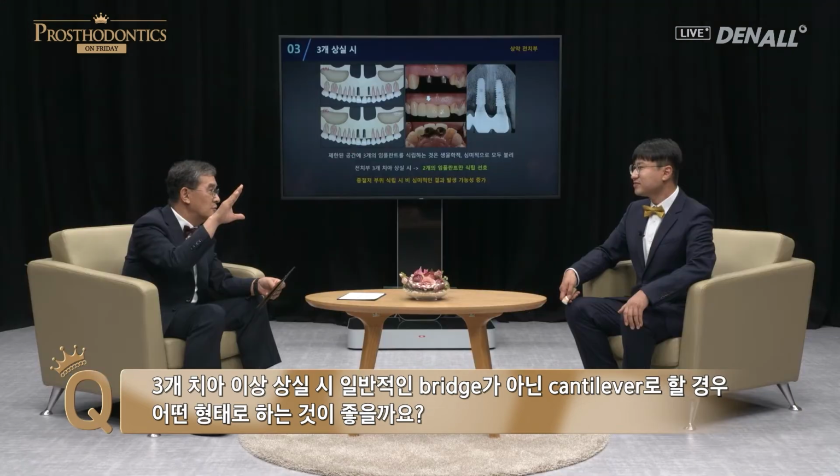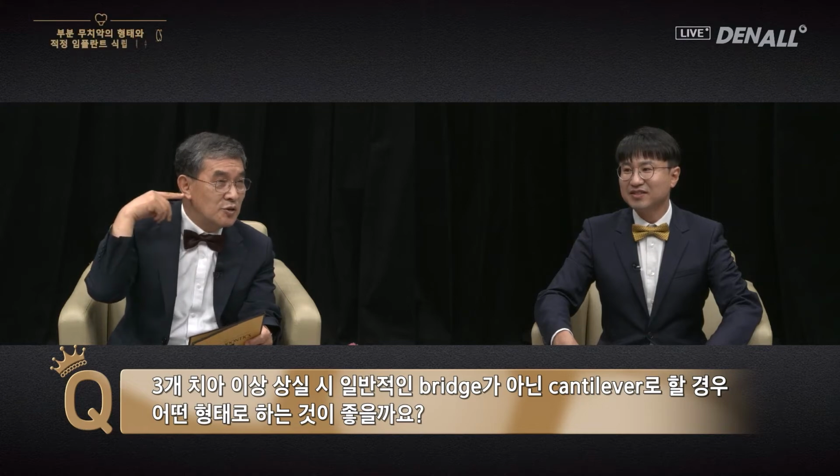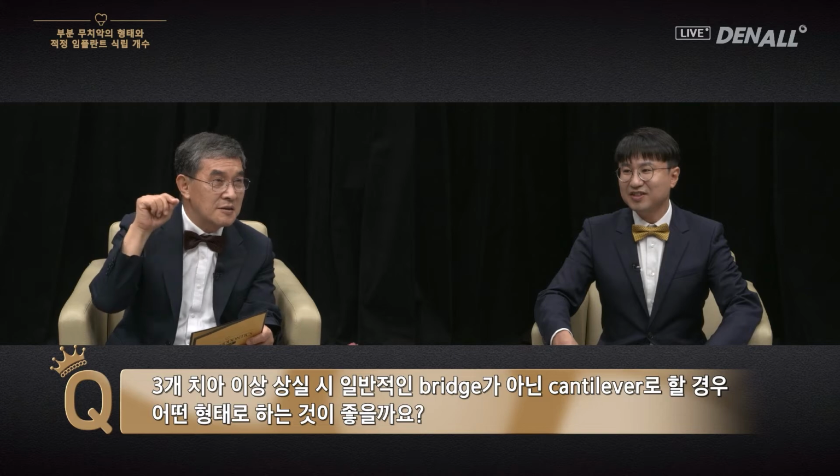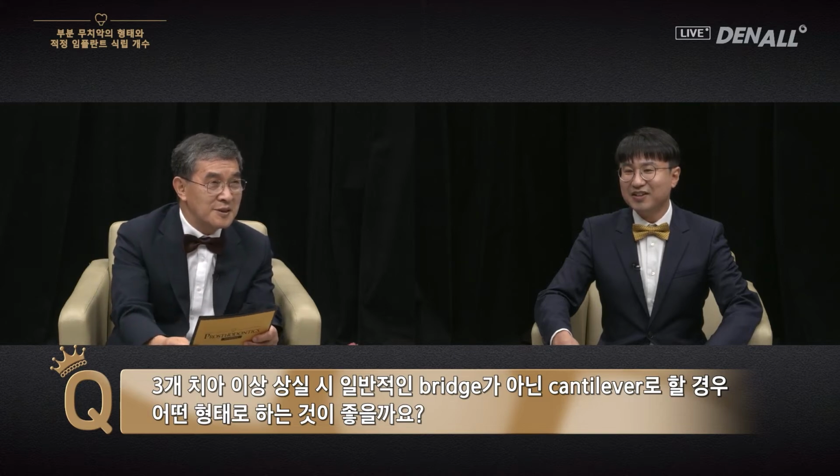However, when you do this, the occlusion should not just be about one articulating paper sliding through. It should be clearly apart by about 0.5 millimeter. I don't use distal cantilever unless the antagonist is a full denture. Our mouth has a leverage mechanism. Therefore, the more posterior you go, the stronger the occlusal force becomes. I agree that mesial cantilever is better than distal cantilever.